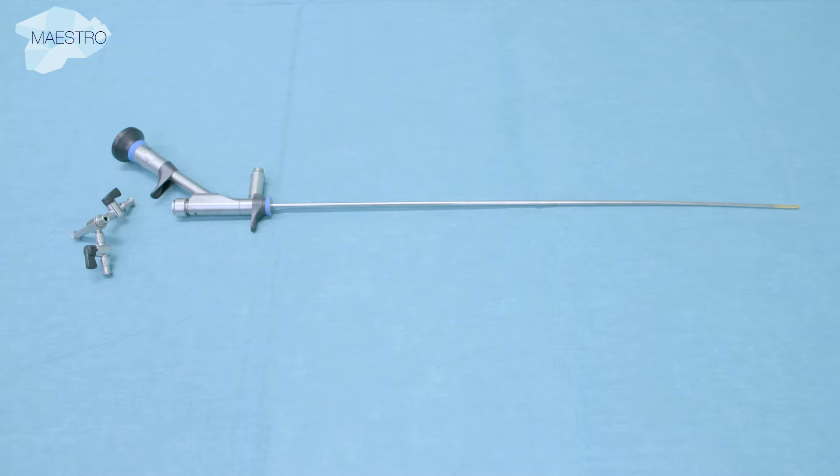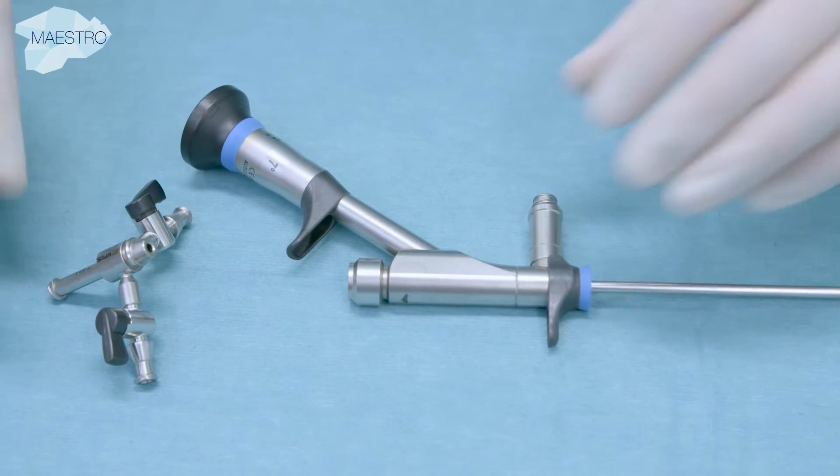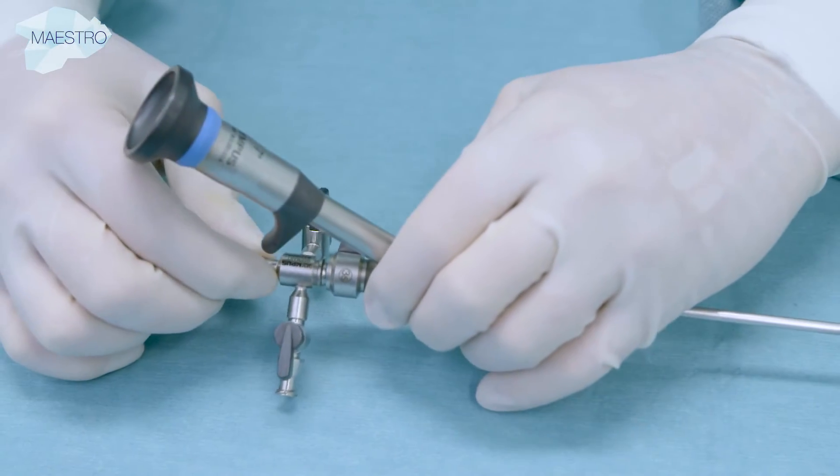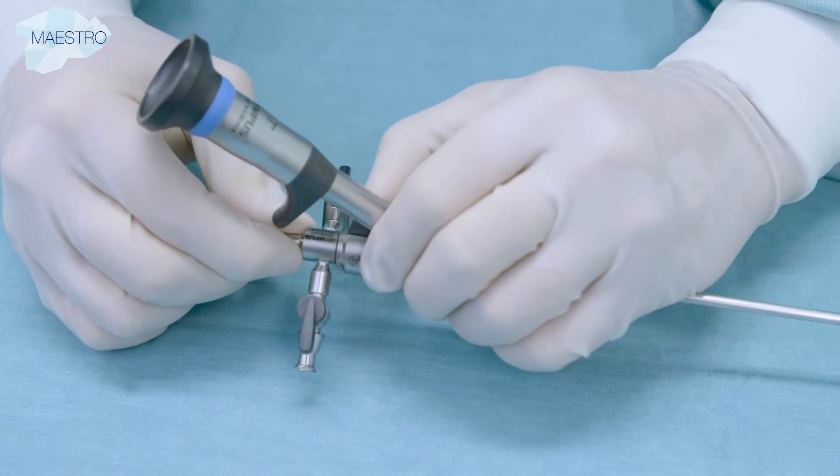This video introduces a semi-rigid ureteroscope that is used for endoscopic ureter surgery. The attachment is connected to the scope with a bayonet mechanism and is exchangeable according to user preferences.